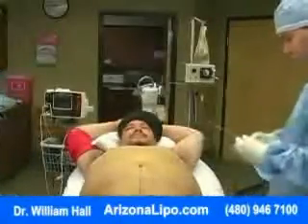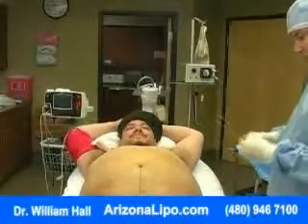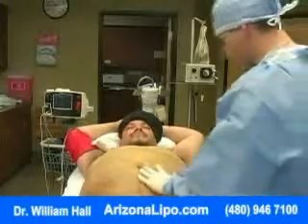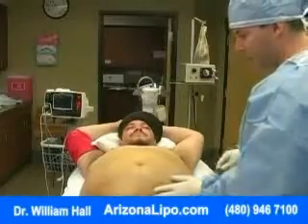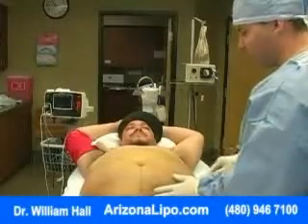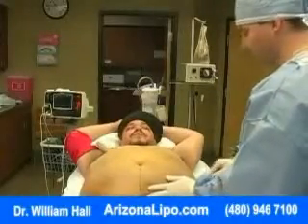Okay, so we're going to start the suctioning now, Alex. Okay. So mainly you're going to feel a little bit of pressure, okay? If you feel anything that is burning or pinching, you just tell me and I'll put a little bit more anesthesia. But mostly it's just going to be a little pressure.